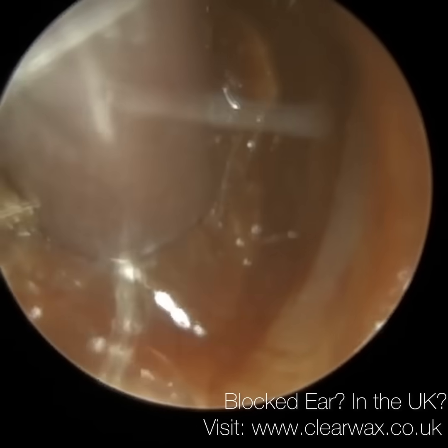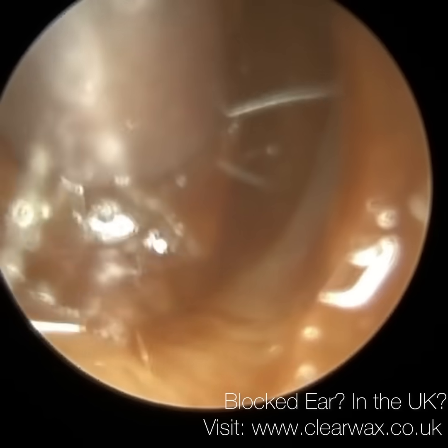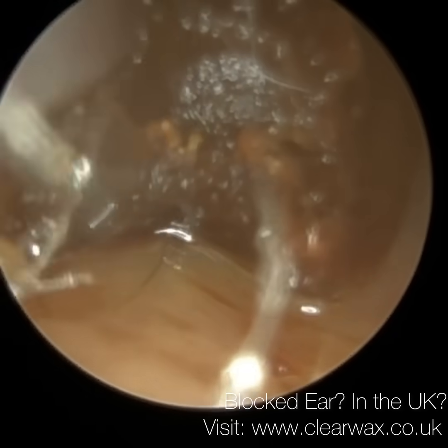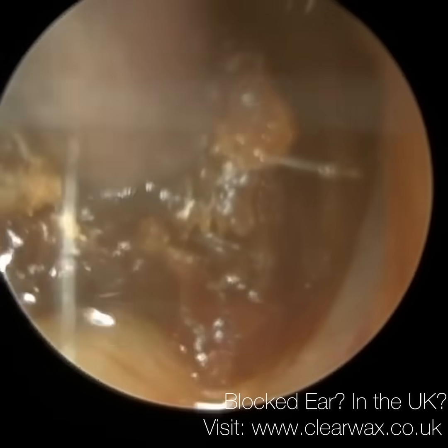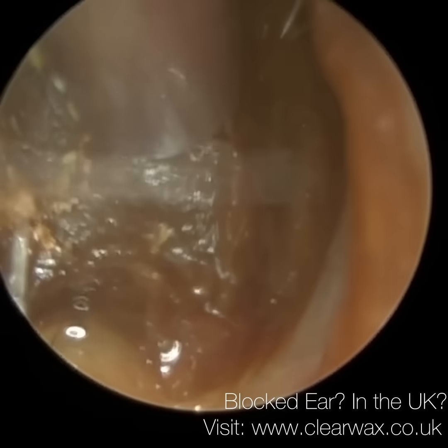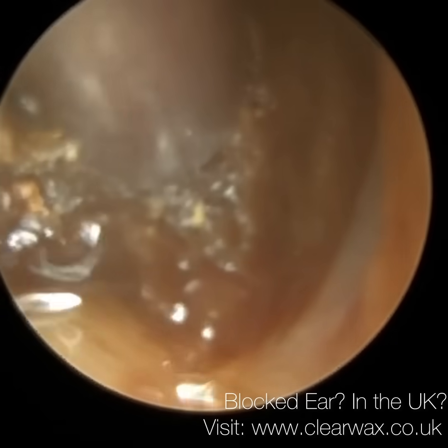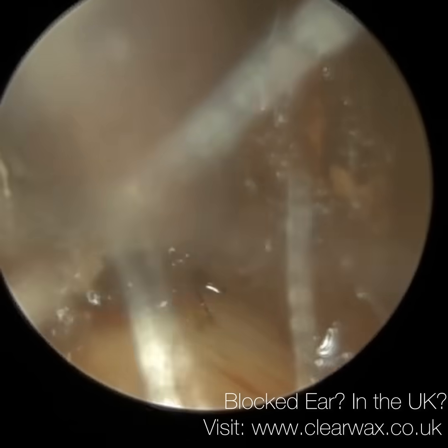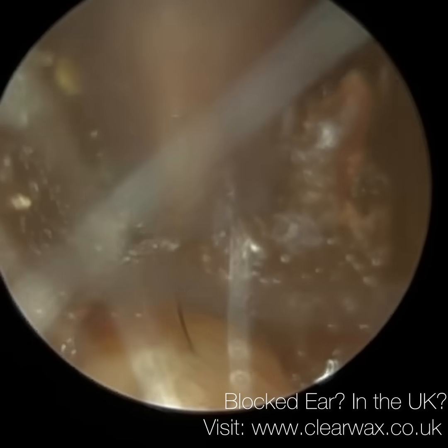I do suction those hairs. I don't actually add it into the final edit, and also dry them with some soft tissue or cotton wool just at the entrance. But inevitably there's going to be some oil, particularly when the oil has seeped a bit deep, and when you're suctioning it, the oil gets attracted to the suction, of course, and some of it, as I'm dragging it out, like this piece of wax, when you're taking out some oily wax from the entrance, it's going to coat those hairs. But all in all, we managed.